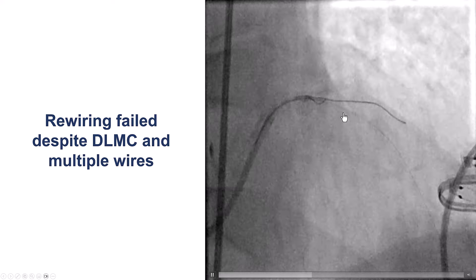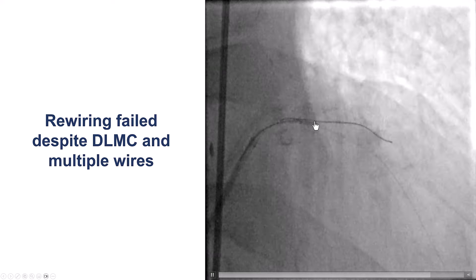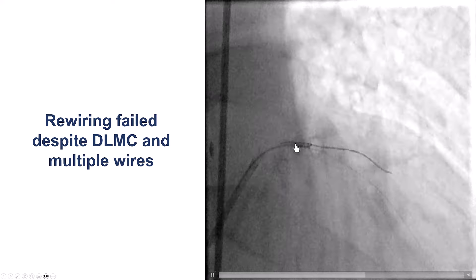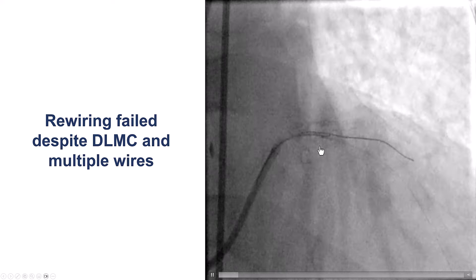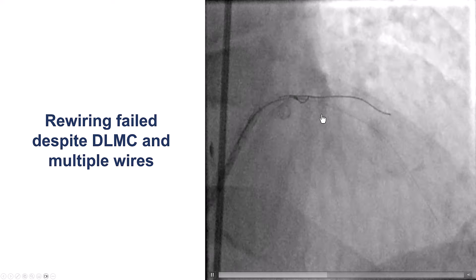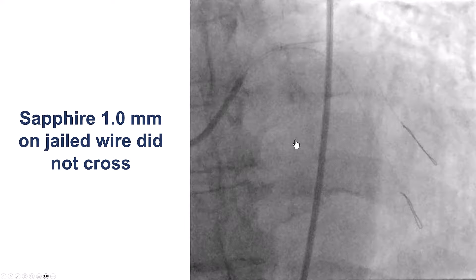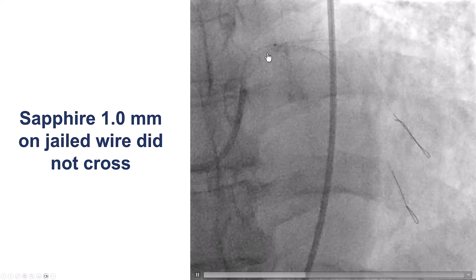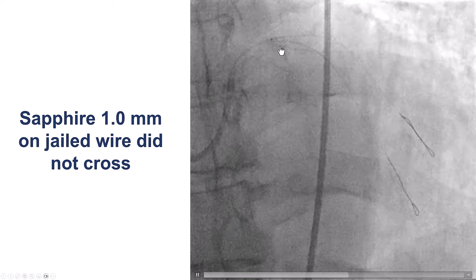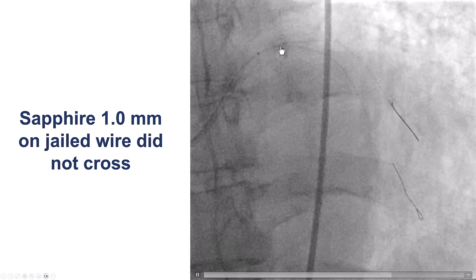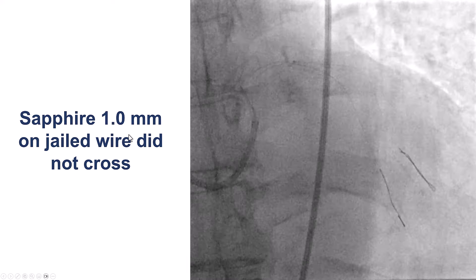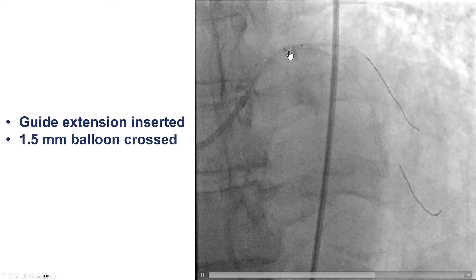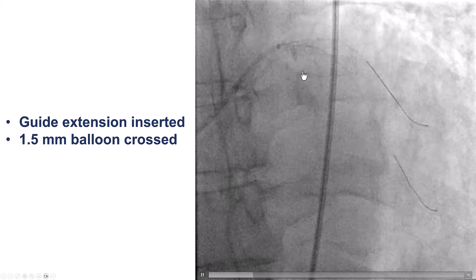Our next step was to rewire the diagonal branch and do a kissing balloon inflation to see if that would improve the flow. However, it proved very difficult to advance a guidewire. We used a Sasuke dual-lumen microcatheter, but even with that we were unable to advance several wires, including workhorse wires and the Sion Black. After multiple attempts, we decided to pre-dilate over the jailed wire to get more flow into the diagonal branch, and then tried again to rewire with the dual-lumen microcatheter, but even a Sapphire 1.0 would not cross. So we used a guide extension, and this time a 1.5 mm Takeru balloon successfully crossed into the diagonal branch and pre-dilated.